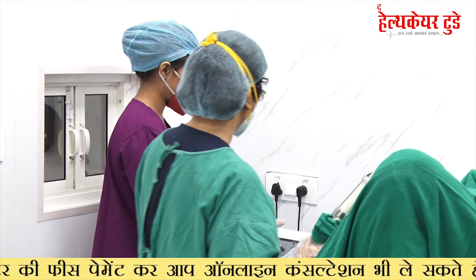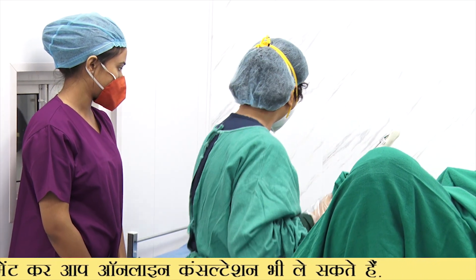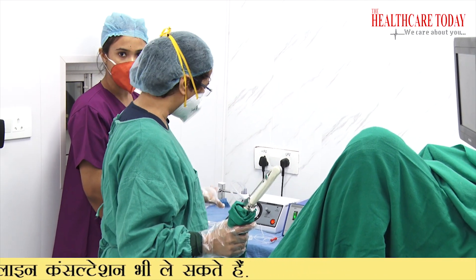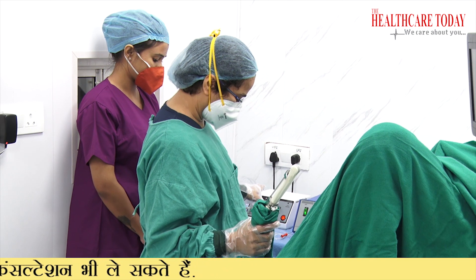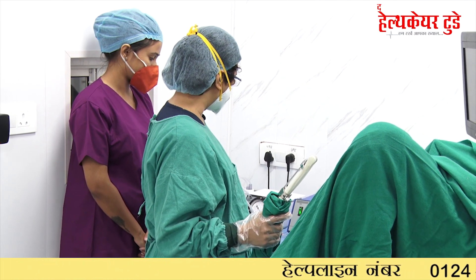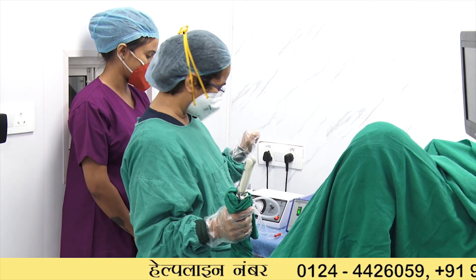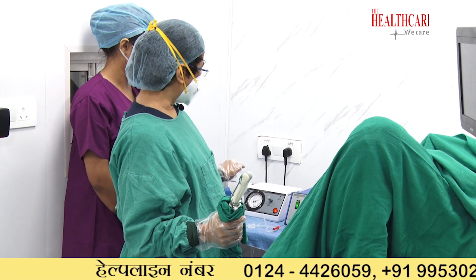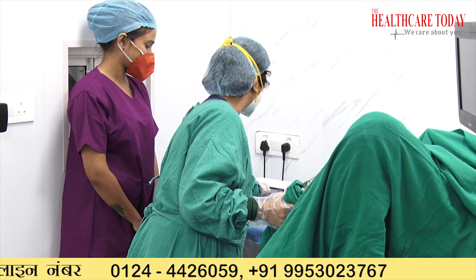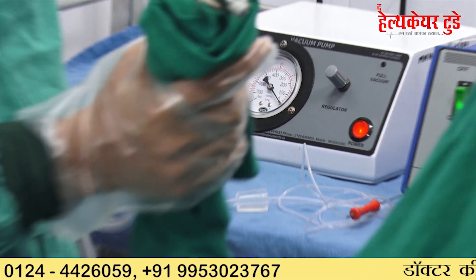Now we have to check all the machines are ready. This is the suction pump from which we aspirate — you have to check it before performing the procedure to see whether it is working properly. Press the button and close the end so pressure is maintained. If the pressure goes up to 300–400, that is not good; you have to reduce it. Now it is coming up to 200, which is fine.